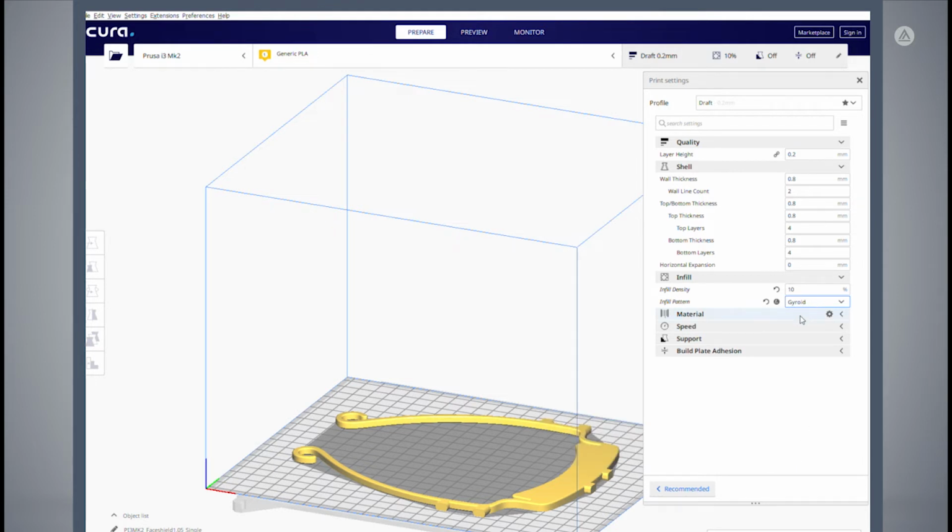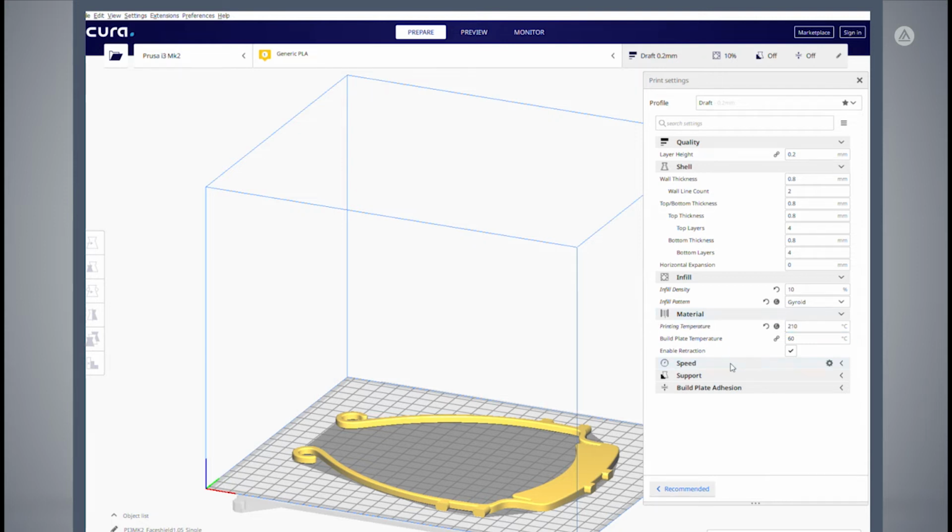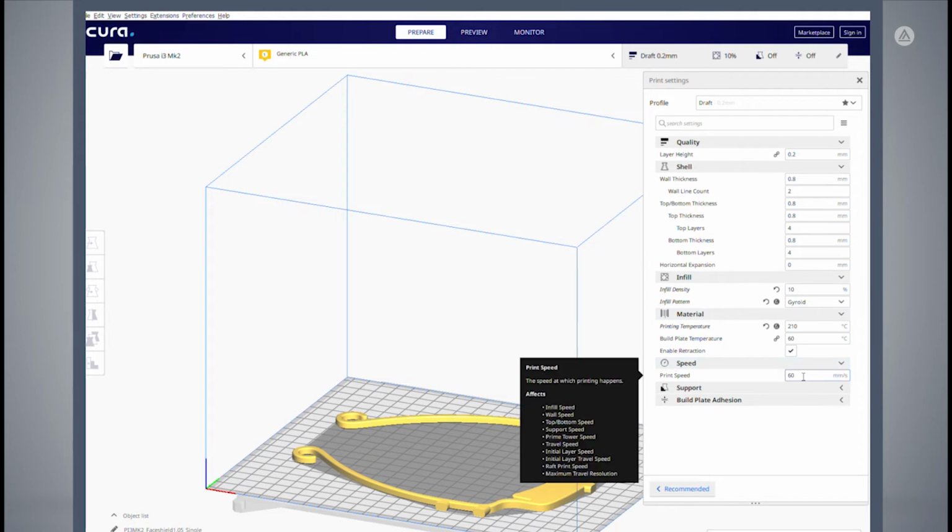For material, this depends on what you have on hand. PETG is preferable since it can stand up to high temperatures and stresses, but if all you have on hand is PLA, that'll be far better for frontline workers than having nothing at all. We'll go ahead and set this for PLA. For speed, we can leave this at the default for your printer, and for our Prusa, this will be 60 millimeters per second. Printing fast saves time up front, but you may spend more time later troubleshooting failed prints.